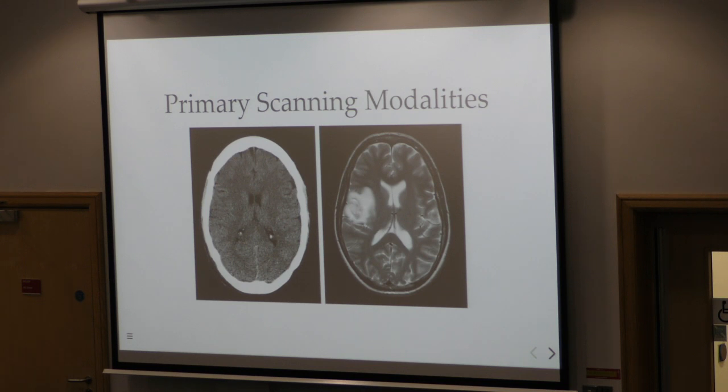So you basically work your way up along whatever given axis you're choosing along the patient's body, and you take these slices, and that way you can build up a three-dimensional volume by layering them on top of each other in what we call a stack.